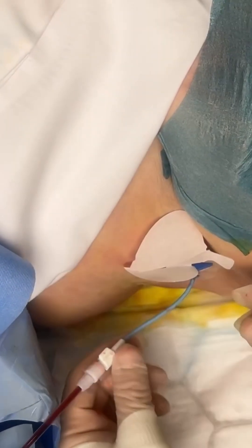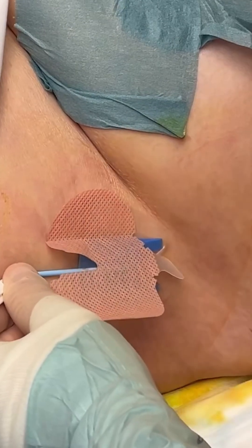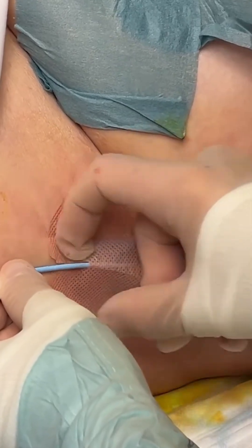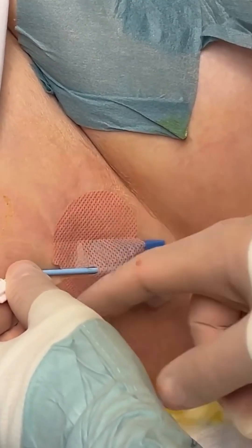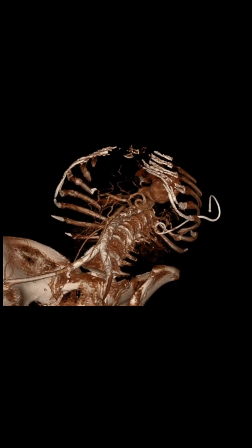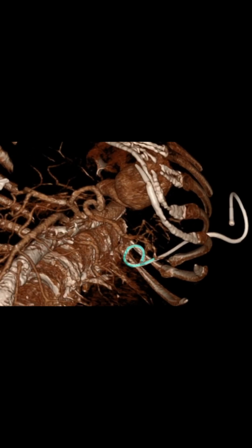Connect the drain and make sure you attach it securely to the chest wall as shown. Fasten the drainage tubing in the ventricaudal direction. This CT shows the tip in the optimal location: dorsal and caudal.